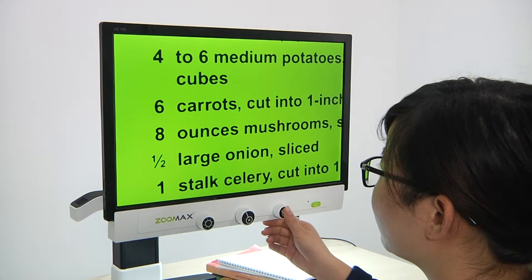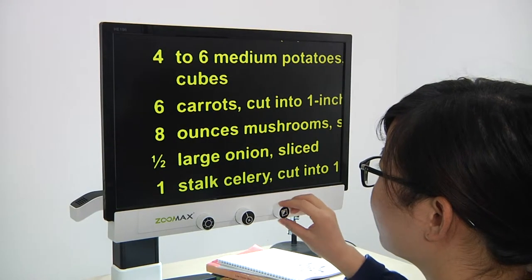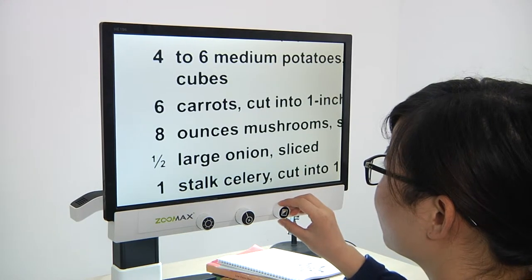You can switch between the default color mode and advanced color mode by long pressing the color mode dial until you hear a beep.